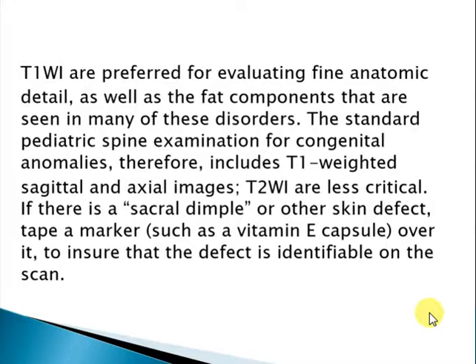If there is a sacral dimple or other skin defect, we can mark it on the skin, for example, by using a vitamin E capsule. Vitamin E is an oil and will be easily seen in the MRI images.